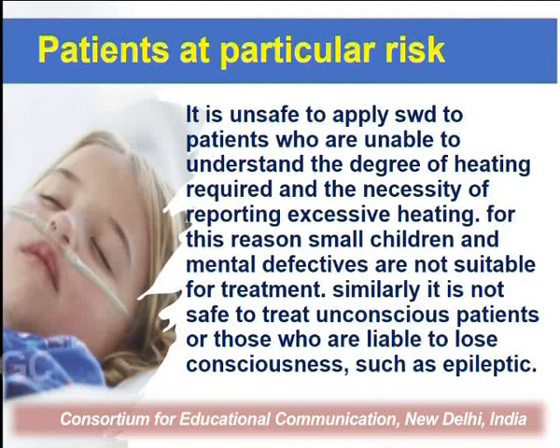Then patients at particular risk. It is unsafe to apply shortwave diathermy to patients who are unable to understand the degree of heating required and the necessity of reporting excessive heat. For this reason, small children and mentally defective patients are not suitable for treatment. Similarly, it is not safe to treat unconscious patients or those who are liable to lose consciousness, such as epileptics.